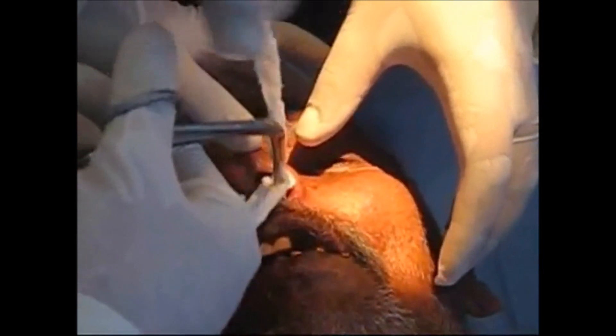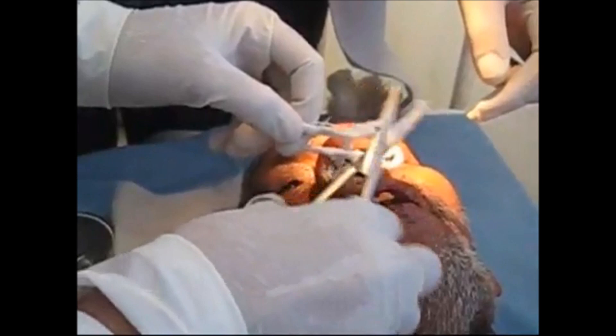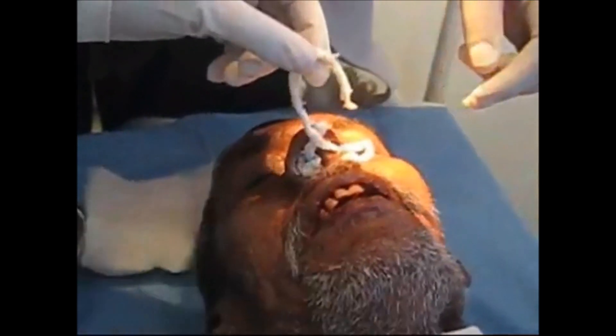After inserting and packing the nose, check the back of the throat to ensure the packing has not come out there. Packing can be applied in the back of the throat and the pharynx.